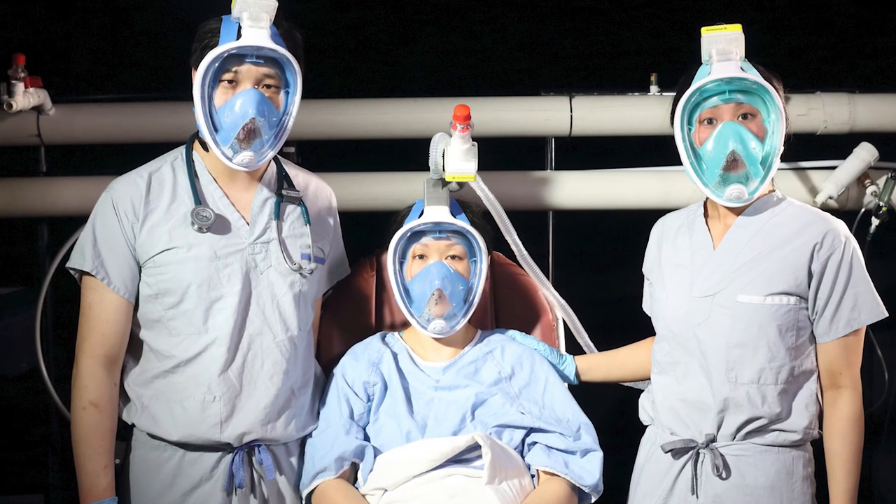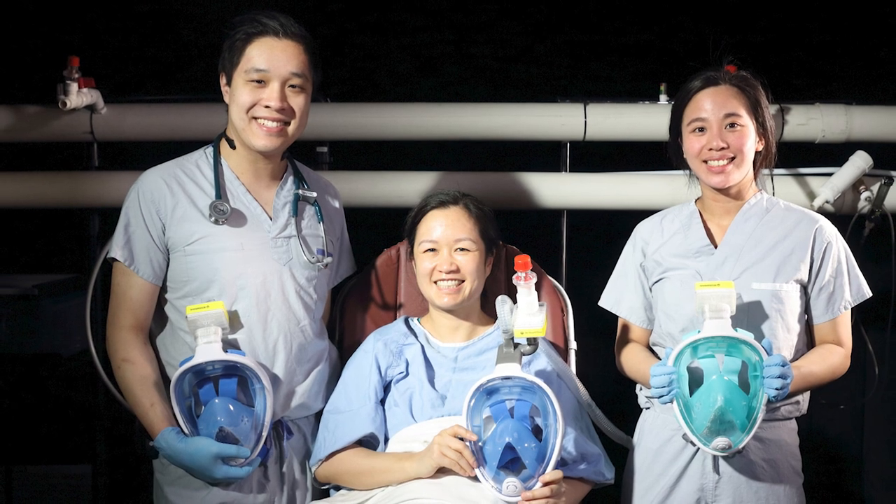While mechanical ventilation is a potentially life-saving therapeutic option, some patients may not need such invasive ventilation strategies and may benefit from non-invasive positive pressure ventilation, such as OptiFlow, CPAP, and BiPAP.